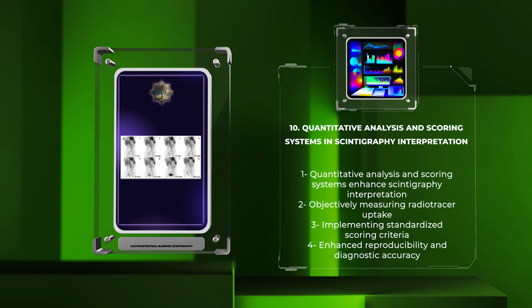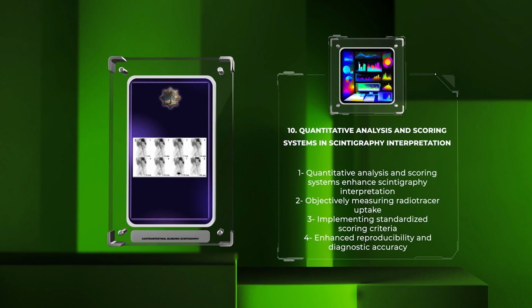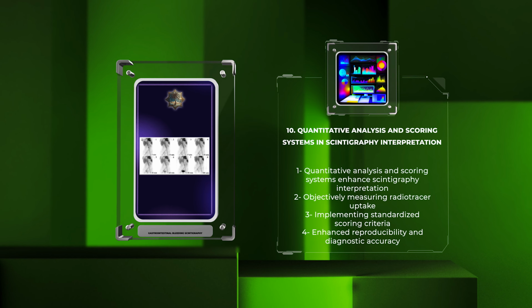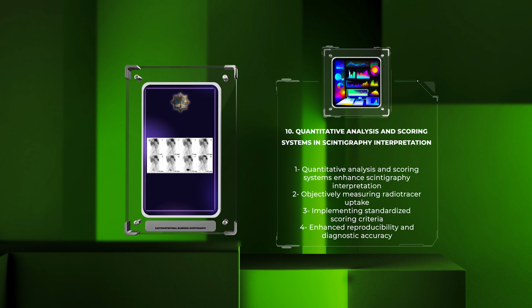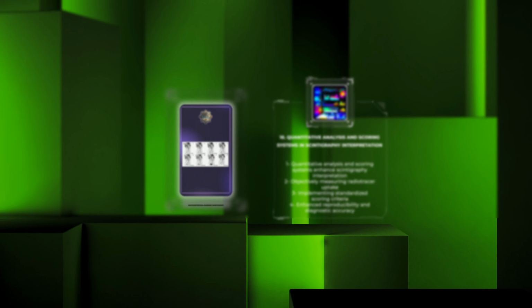By objectively measuring radiotracer uptake and implementing standardized scoring criteria, radiologists can enhance the reproducibility and diagnostic accuracy of scintigraphy interpretation. Quantitative analysis and scoring systems provide a more comprehensive evaluation, aiding clinicians in decision-making processes for optimal patient management.